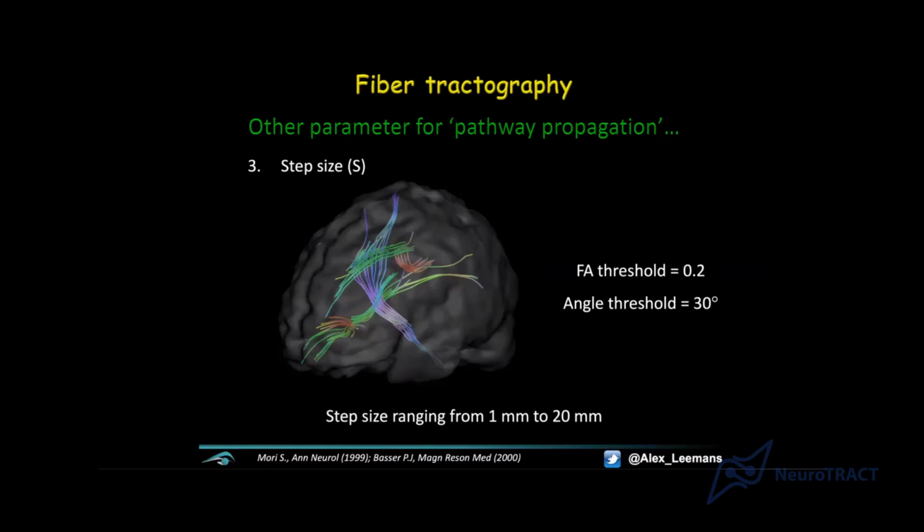Another disadvantage of very high resolution data, obviously, is that it will take longer to acquire. So can you imagine you're in a medical facility and a person has some head injury? Or you want to do pre-surgical planning, but the patient is suffering from epileptic seizures, and it's difficult to lie still in the scanner for a long time. Well, lying in the scanner for a very long time is not possible, right? So there's a limit to the amount of time somebody can lie still in the scanner.